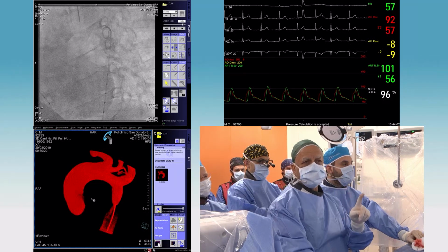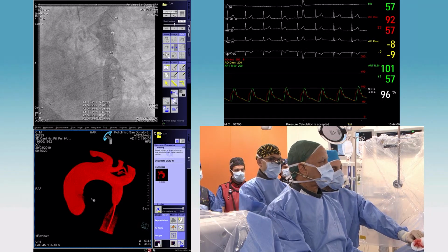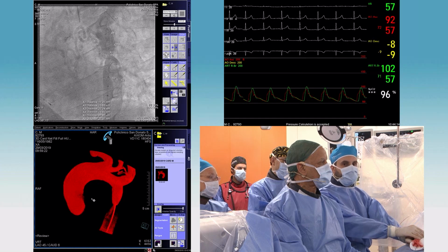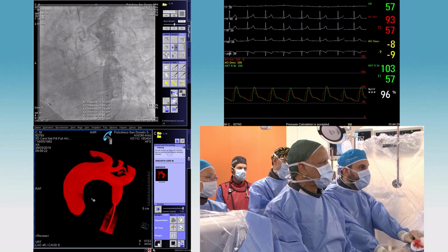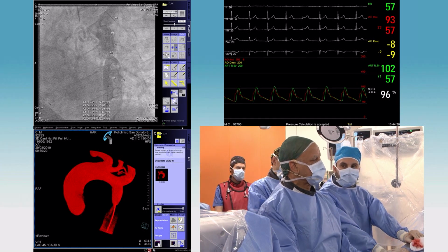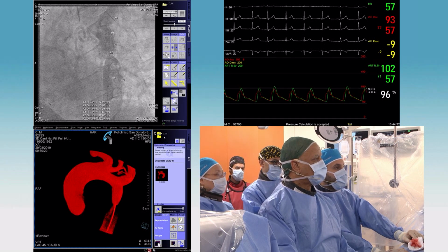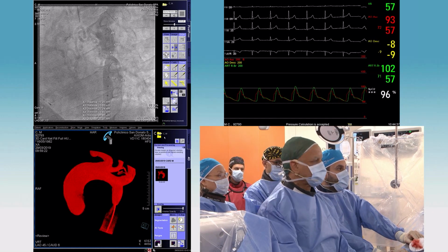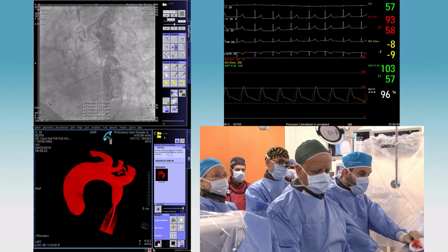So we've got measurements for you, Carlos. To me, the isthmus is not that bad. Yeah, there you go. Beautiful. So the length that you mentioned, from the left subclavian artery to the coarct, is about 27 millimeters, and then I've just picked a random measurement below that, so another 27. So the whole very long segment would add up to 54, but obviously we won't have a stent of that length. My focus would be to do the top bit and the coarctation, and then have a bit of the stent hanging down. Does that seem reasonable? Perfect. Yeah, that sounds good.